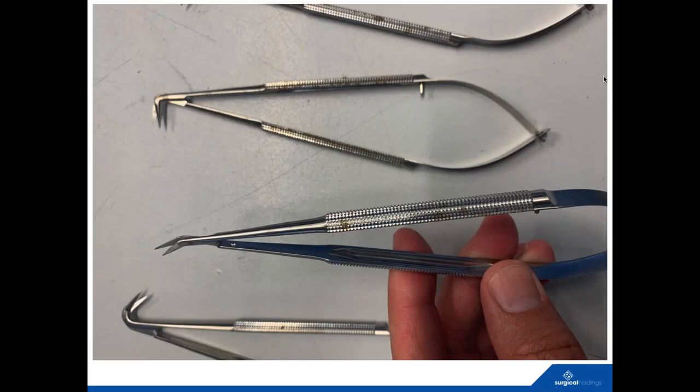But yeah, it's just vigilance and spotting these different surface changes before they become a real problem. And these are produced by one of the top manufacturers in the world. There's no issue with the steel or anything here. They're top quality devices, but anything can happen when you've got these mixes of chemistries involved.